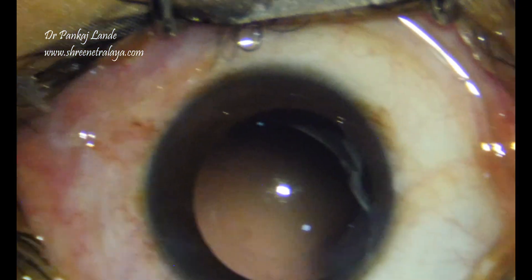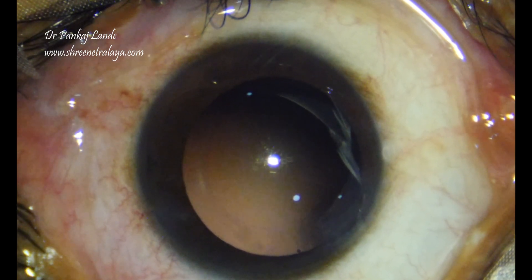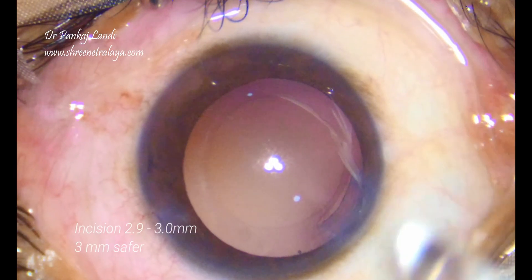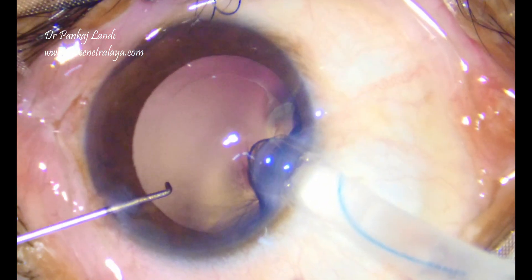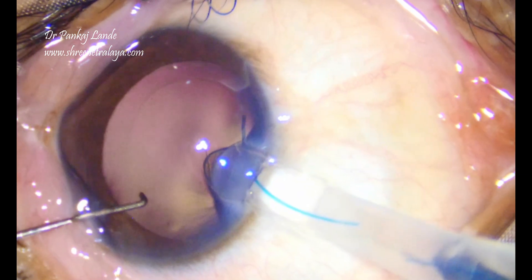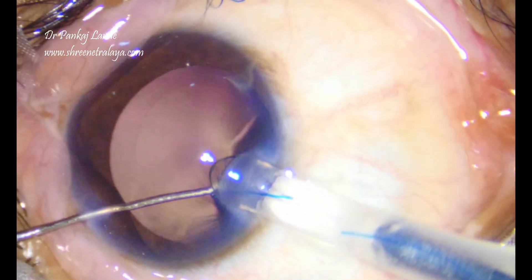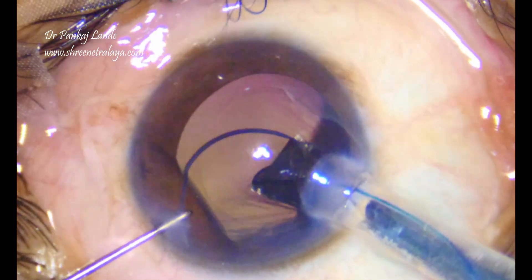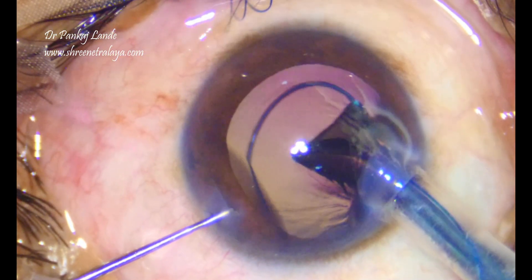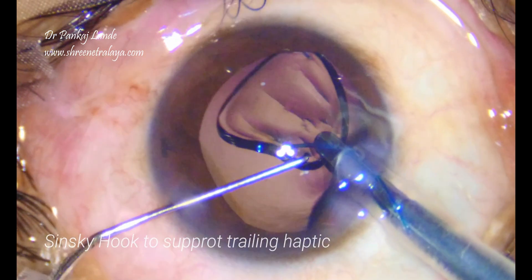Now with an incision of 2.9 to 3 mm, the IOL is being injected. You can rotate your hand slightly to the right side and use your left hand instrument to manage the leading haptic in the correct position so that it will go comfortably into the bag without any kinking, or without going into the anterior chamber or sulcus.